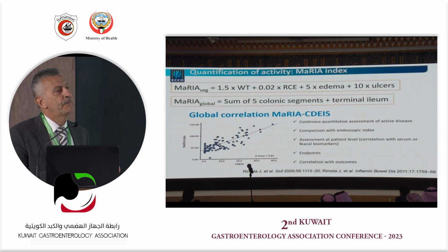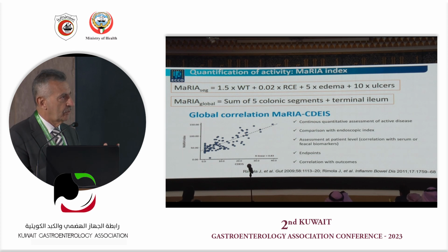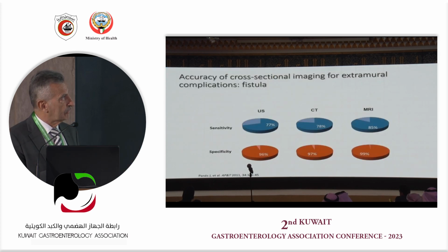So if you would like to be more accurate, and this is more relevant in clinical trials, you can evaluate a score. It's a bit troublesome, but with a bit of training, you can use this kind of MRE score that was proposed by the Barcelona group. You see there is quite a good correlation with the endoscopic evaluation of this patient. This is relevant in the follow-up of patients, especially in controlled trials.